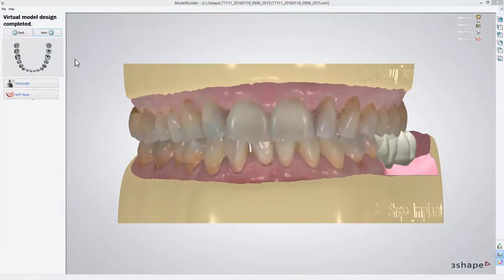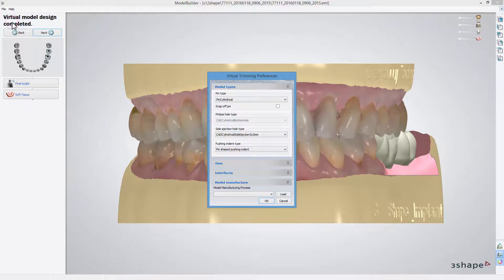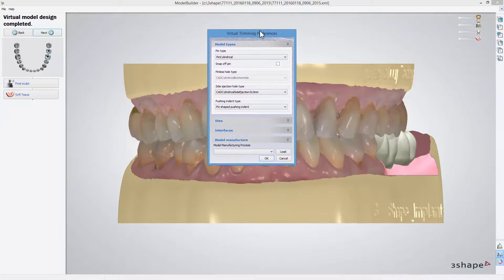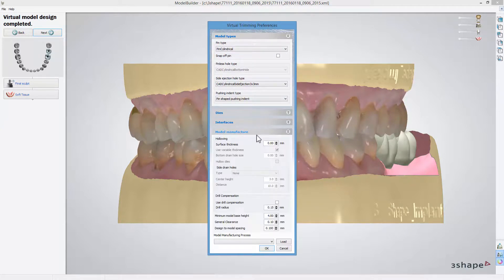Now you can check your design. Go back to add some changes, like enabling a hollowed model. To do that, choose File from the top menu, then Trim Settings. In the Model Manufacture menu, set the value for surface thickness and click OK.